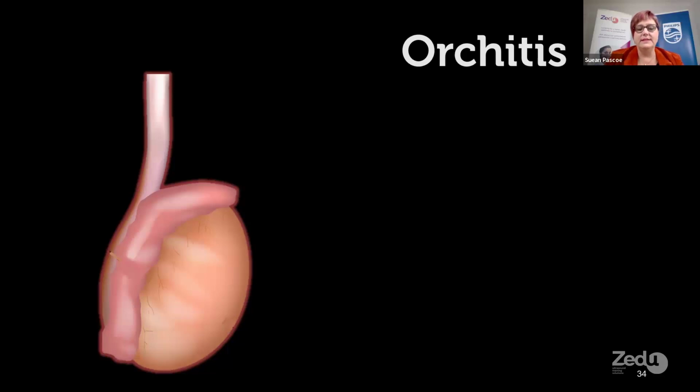And of course, the Doppler signal is giving you a Doppler spectrum for anything that moves. The idea is if your hand is still, the only thing moving is the blood flow past the probe, and so it codes that moving blood flow. But if you can't keep your hand still, then everything is color, and you're not going to be able to sort out what's color in a vessel versus what's color from your hand movement.